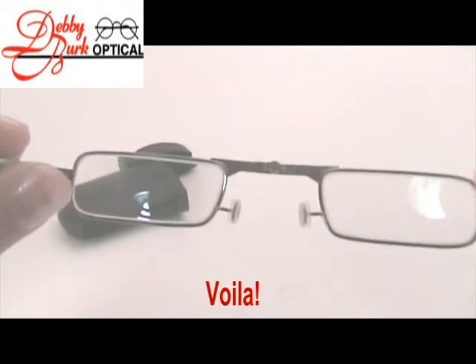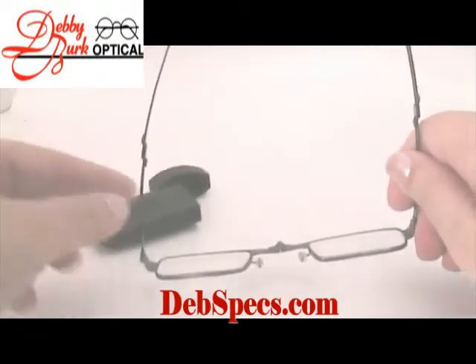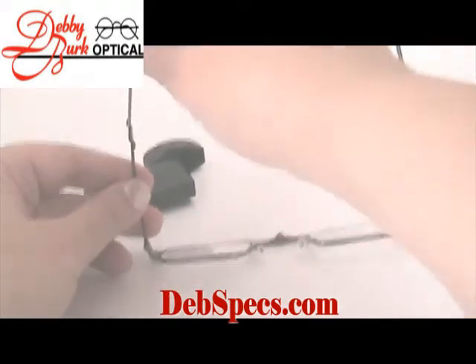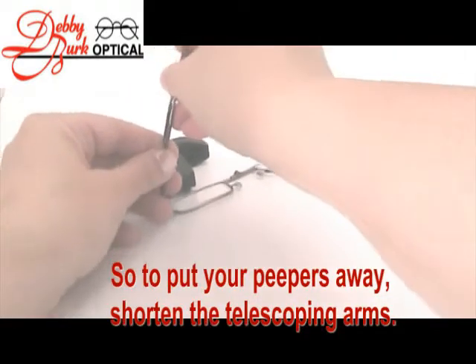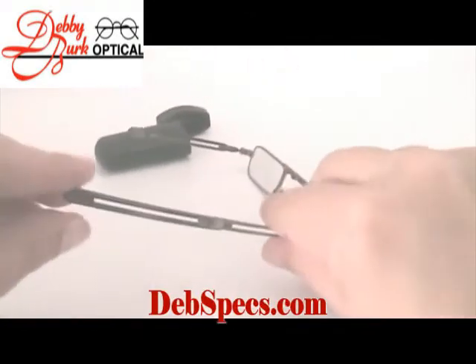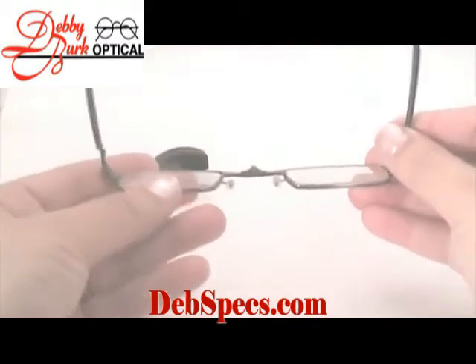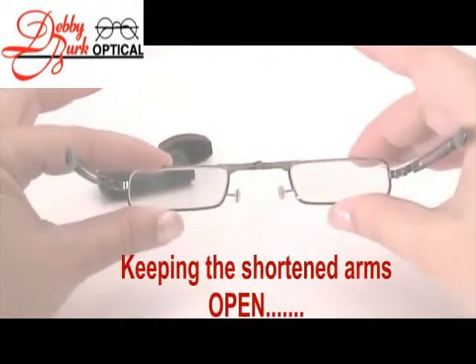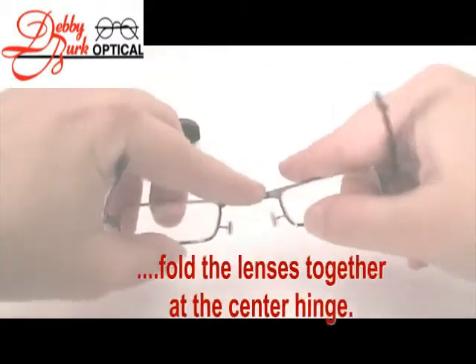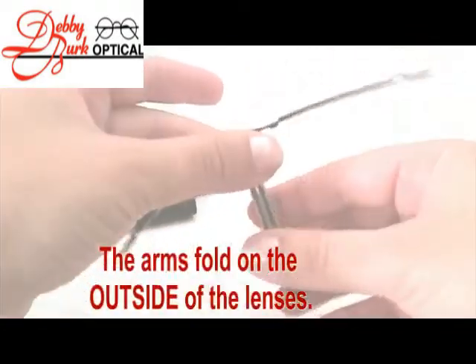And voila! To fold them up, we basically reverse the procedure. First, use the telescoping arms to shorten them by pushing at the end. Don't fold the arms in yet. Remember to keep them open as you take the hinge between the frames and approximate the lenses.